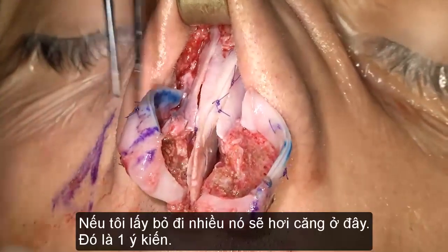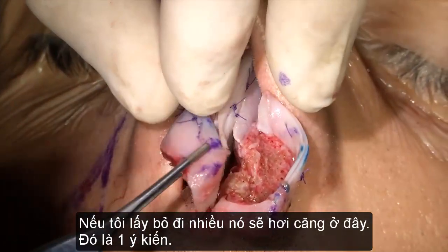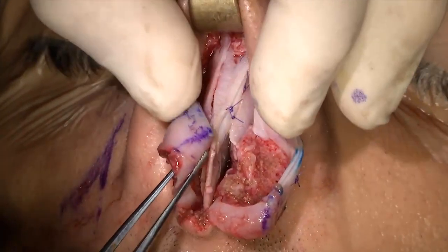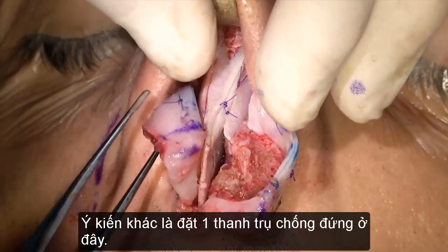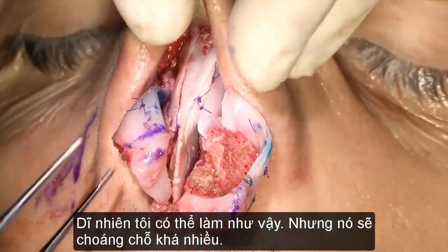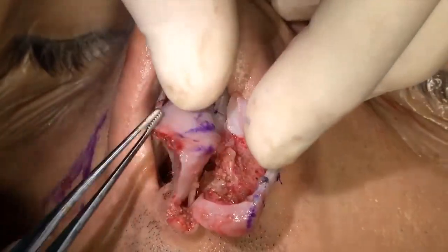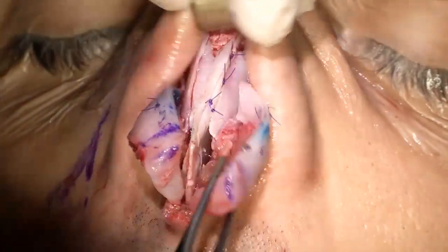All right, so if I take this down a lot, and if I tension here, that's one option. The other option is to have a strut here. Of course, I can do that, but that will occupy space. I could actually strut this area, like this.